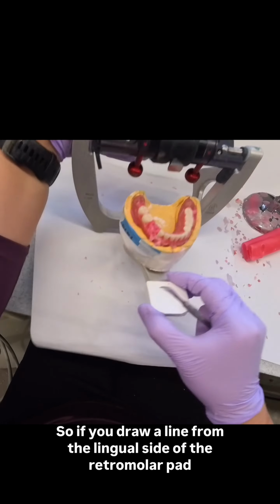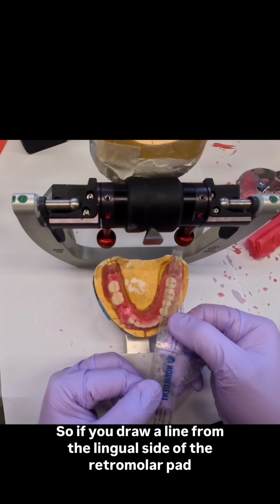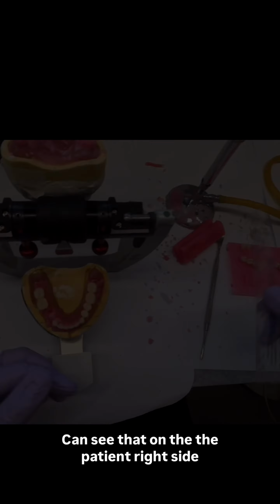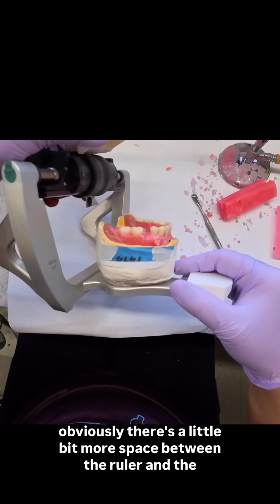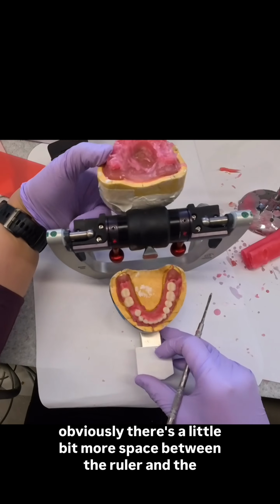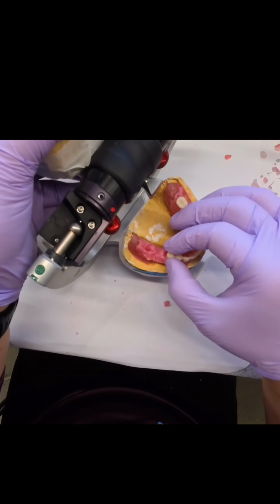Alright, so if you draw a line from the lingual side of the retromolar pad to the mesial of the canine, you can see that on the patient's right side, obviously there's a little bit more space between the ruler and the previous teeth setup, and that's what I was adjusting.